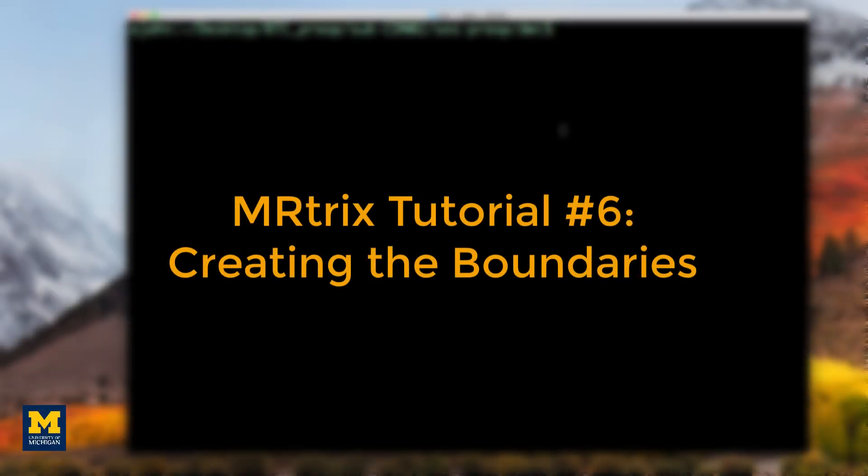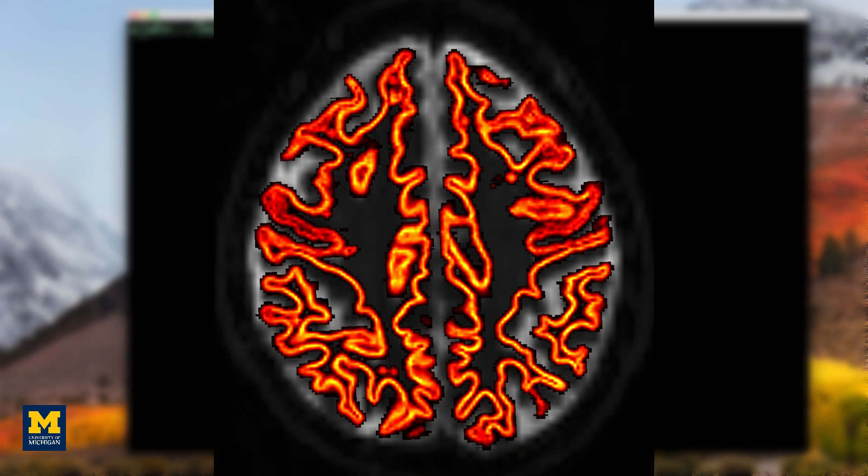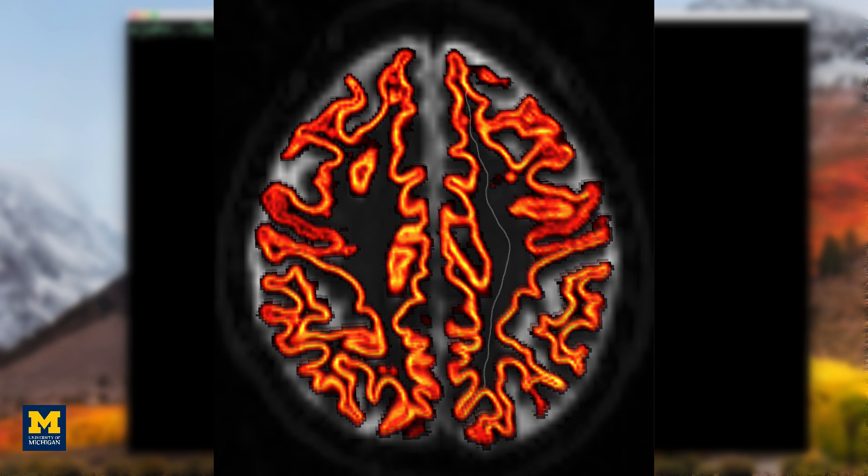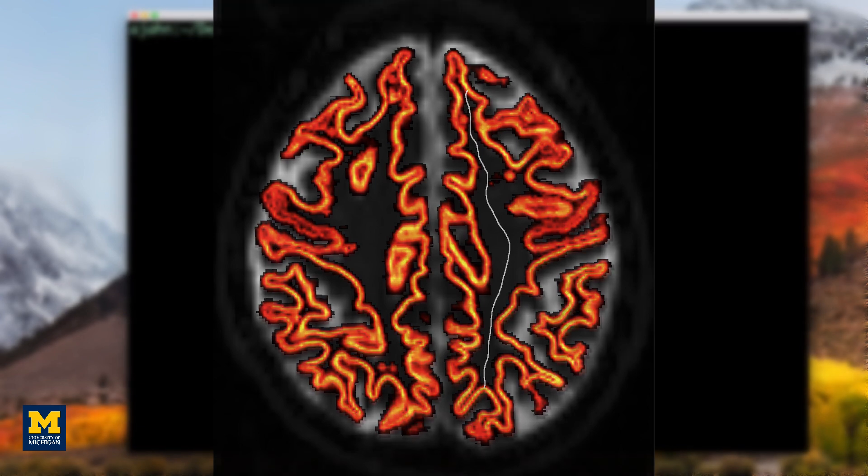We are almost ready to begin our streamline analysis, in which we put seeds at random locations along the boundary between the gray matter and white matter. A streamline will grow from each seed and trace a path from that seed region until it terminates in another region.